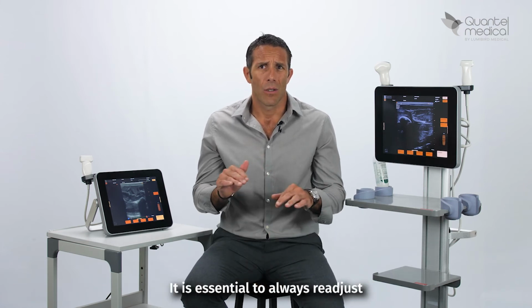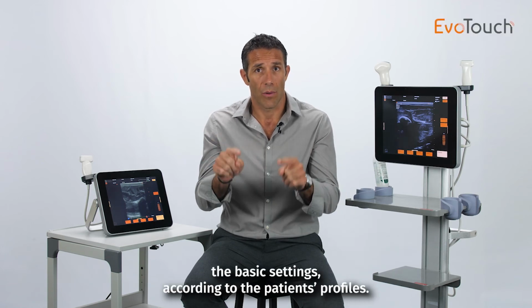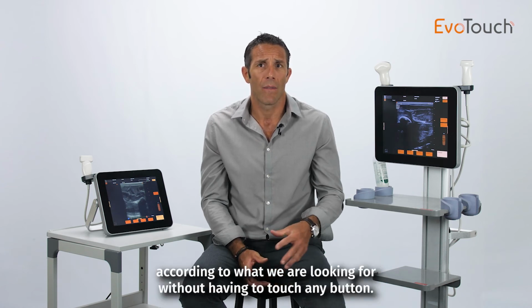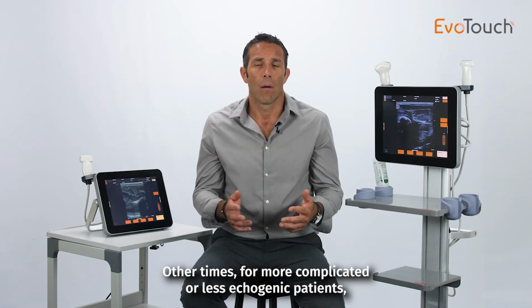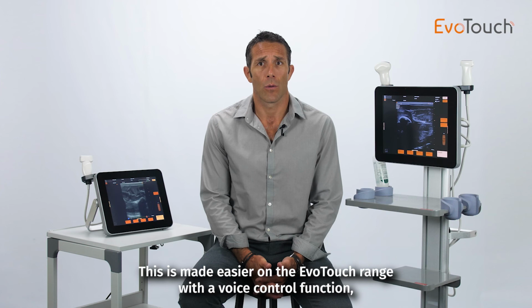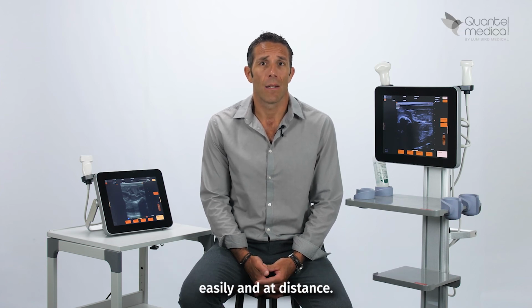It is essential to always readjust the basic settings according to the patient profiles. Sometimes the basic presets will offer the right image according to what we are looking for without having to touch any buttons. Other times, for more complicated or less echogenic patients, it will be necessary to adjust some settings. This is made easier on the EvoTouch range with the voice control function, which allows you to control key image settings easily and at distance.